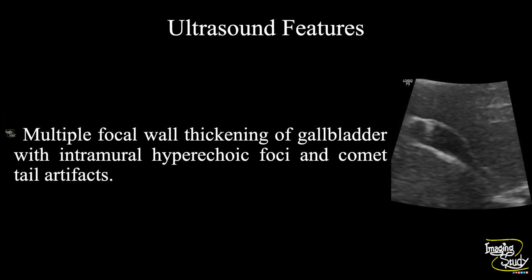So in summary, multiple focal wall thickening of the gallbladder with intramural hyperechoic foci and comet tail artifacts are noted, indicating adenomyomatosis of the gallbladder.